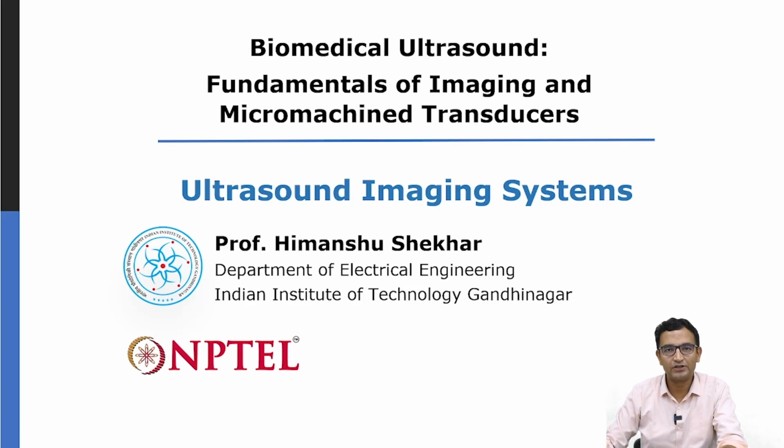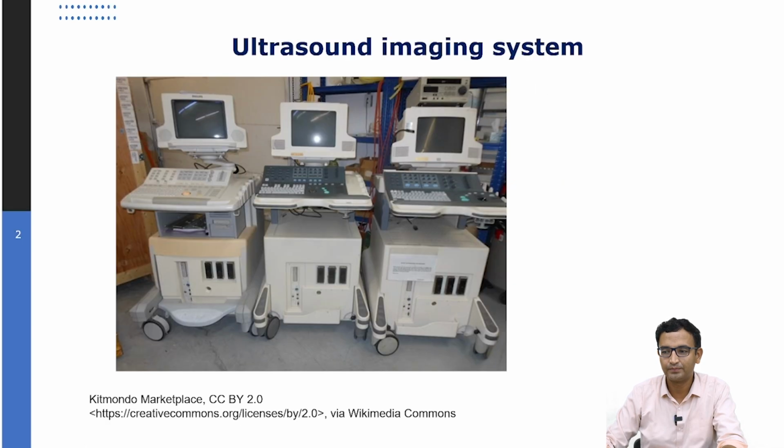Hello and welcome to the lecture on ultrasound imaging systems. As you will recall, ultrasound is a non-invasive, relatively inexpensive and non-ionizing medical imaging modality.